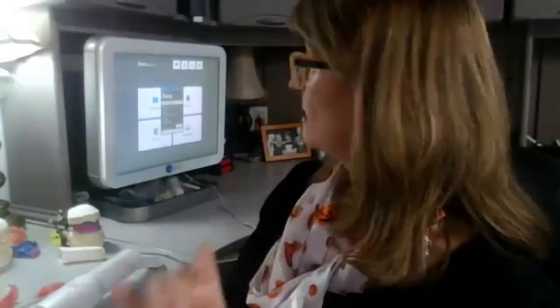The reason that can be helpful is the glare, the shine that you experience in your operatory when you're scanning the denture. Sorry, I had to re-log back into my scanner. It causes light reflection, so that's why the spray can be helpful. If you can create a little shadow for yourself, make sure the overhead light is off and don't stand beside a window. Just go into a corner and try to scan the denture. In my opinion, that would work just as well as one of the sprays.